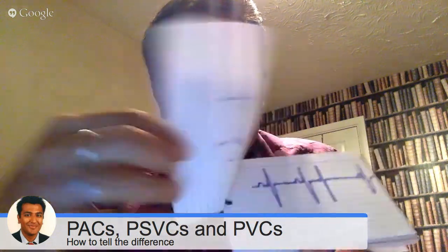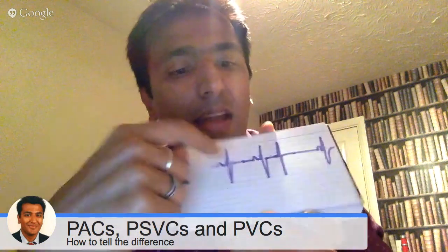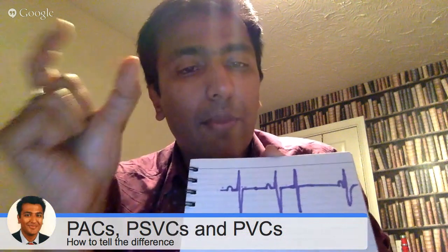Then if you have this where you've got a P wave here, a normal complex, and then you get something which is again thin, i.e. it's still a narrow complex, the width of this QRS duration is still narrow, and there's no P wave, then I would call that a supraventricular complex. So I know it's from above the ventricle because it hasn't become broad. Remember, the lower down the impulse comes from, the broader it gets. So I know that this is not in the ventricle because it's still not broad. And by broad, I mean more than 120 milliseconds.